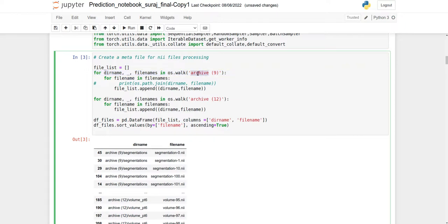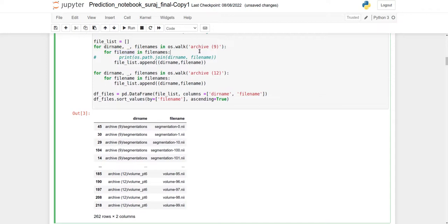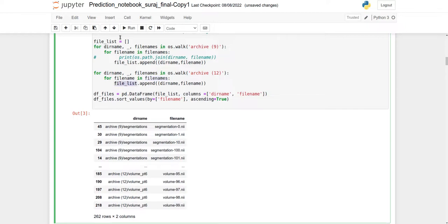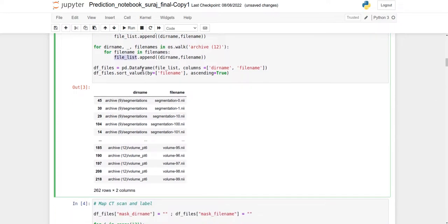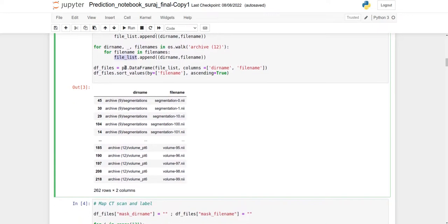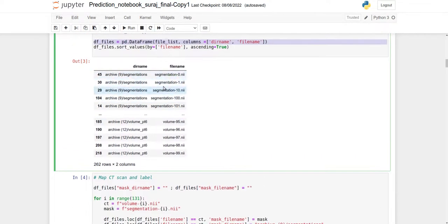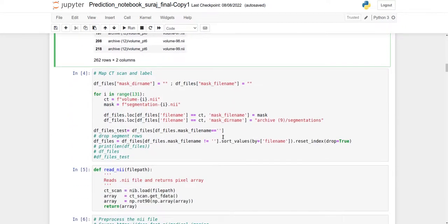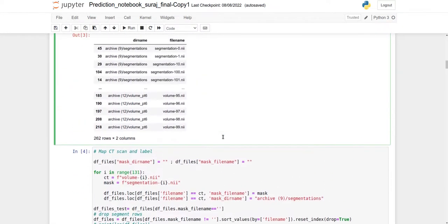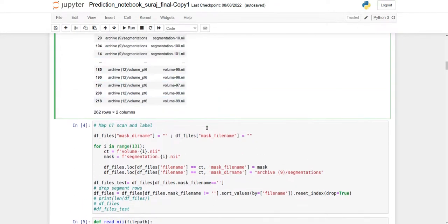First, read all the images using os.walk to get file names from Archive 9, then from Archive 12. All files get appended to a file list. This file list then gets converted into a Pandas dataframe.